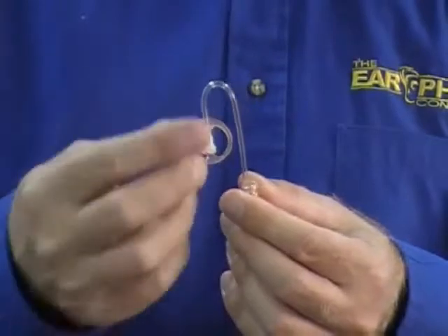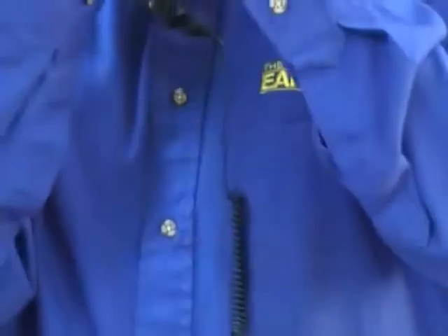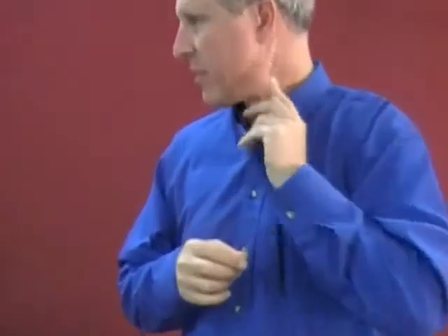The ball on top goes to the top of the ear. I'm going to hook this up and massage it into my ear. That's the way it should look in the ear.